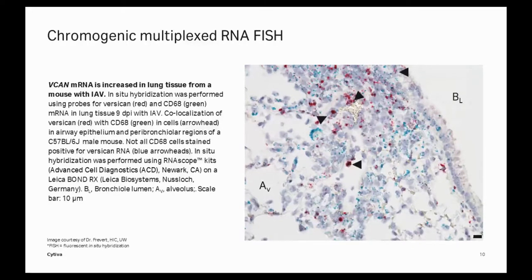The problem with that kind of immunohistochemistry is we're limited in the number of things we can look at the same time. So here's a two color. It's actually RNA fluorescence in situ hybridization. But you can see there's a blue labeling in the stain with the arrow on some of the arrows. And we can also see red staining with some of the other arrows.